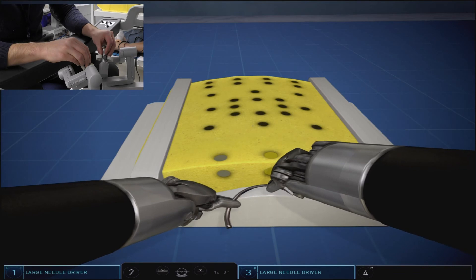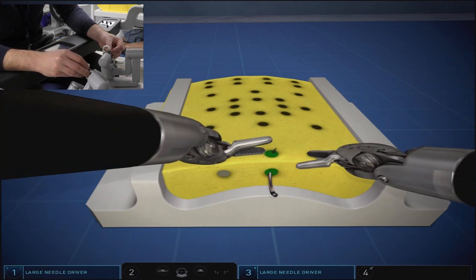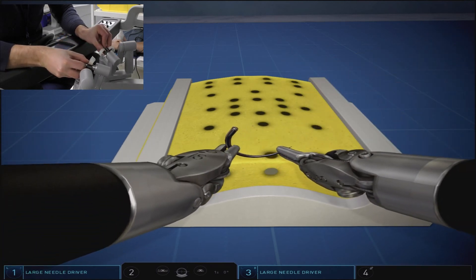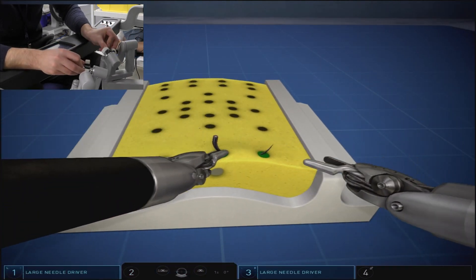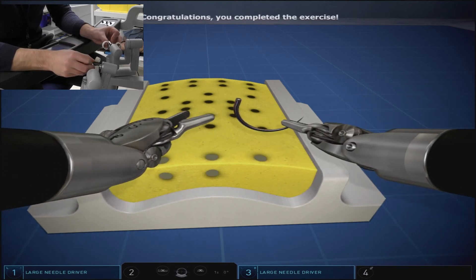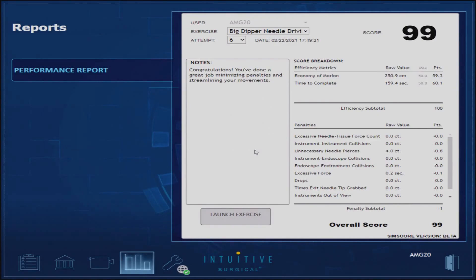Corner throws can be done with either arm in the vertical direction. We did it with the left arm because we had reloaded and pulled the needle through with the right, making our moves that much more efficient. Keys to scoring successfully on this exercise require you to be patient, take your time with entry into the proper position, pay attention to orientation, and avoid excessive needle pokes and sticks in non-designated areas.